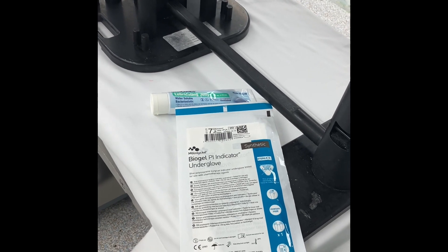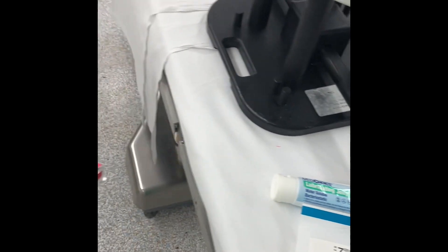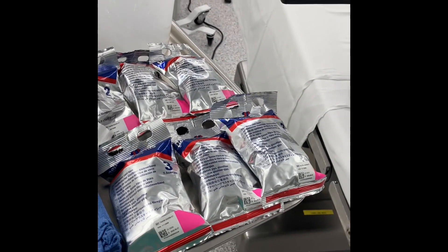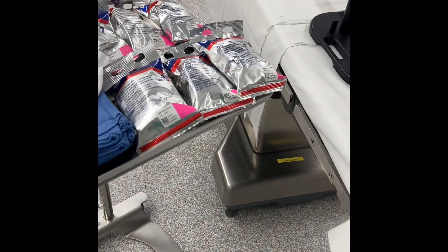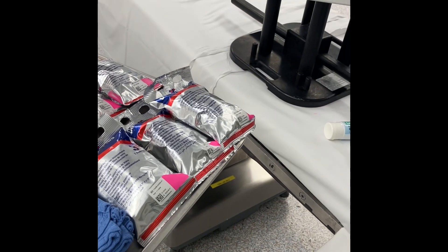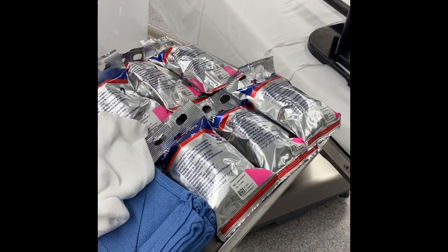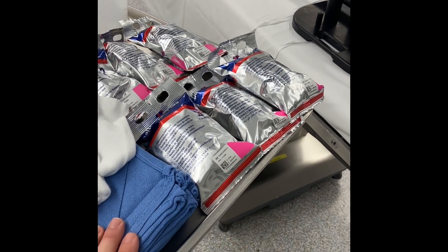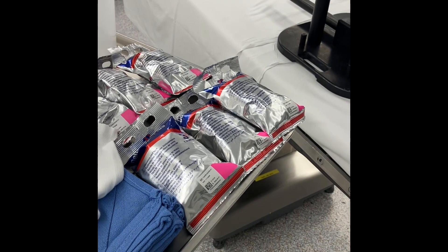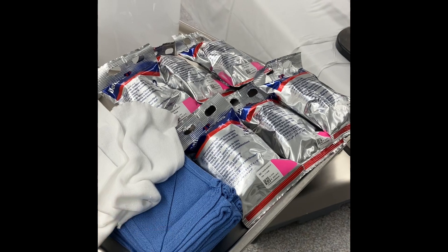Our particular doctors like to use some lubricating jelly at the end of the case and they'll just rub it all over the casting material to help it be a little bit less sticky for the patient. The towels that I mentioned earlier that go around the patient's waist, they leave on until the cast is completely dry. When the cast is totally dry — like when they go to recovery — then they'll pull those towels out and the patient would just have the cast.